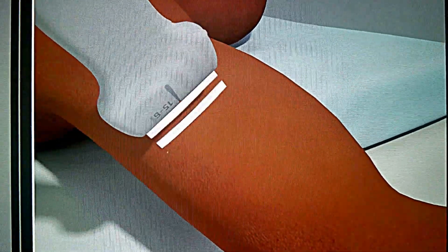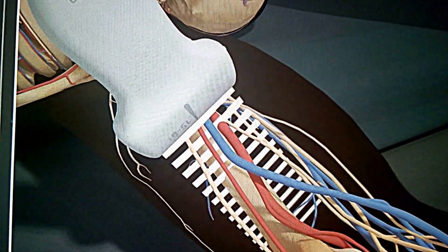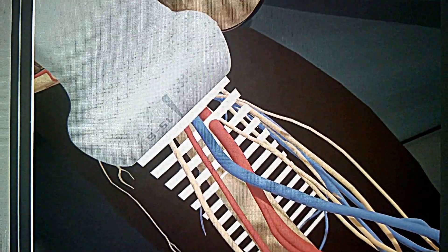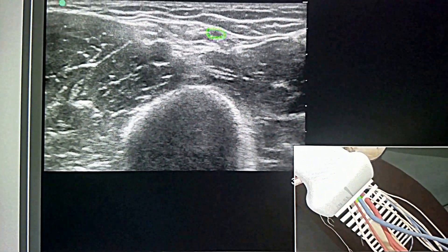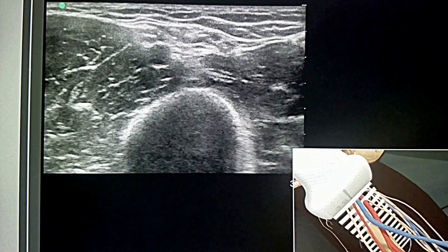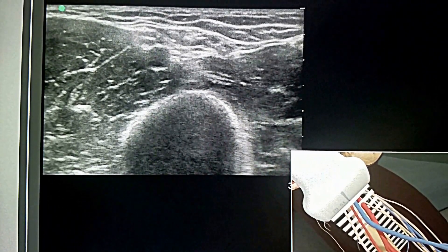The transducer is placed transversely just proximal to the medial condyle in the bicipital groove with the orientation marker directed to the patient's right. The basilic vein is seen as a dark anechoic circular compressible structure in the mid-portion of the ultrasound image between the biceps and triceps muscle.